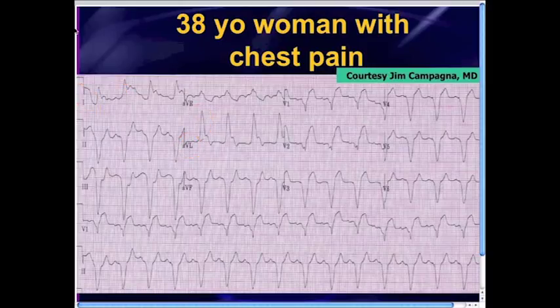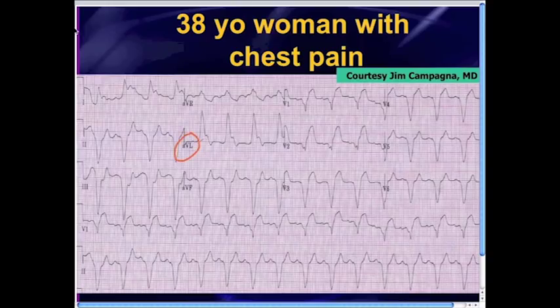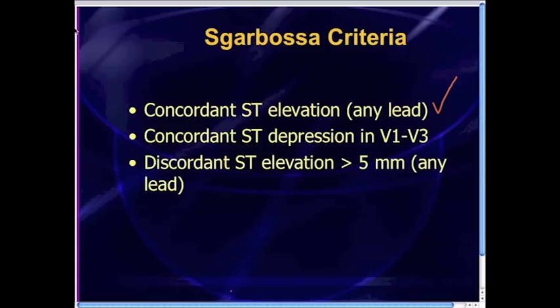All right. So 2 cases. One of them's a repeat from February 12th, but Dr. Anderson is provided with yet another case of a patient with an acute MI in the presence of a left bundle branch block pattern. So once again, Sgarbossa's criteria originally applied to left bundle, now can be applied to pacemaker EKGs as well. If you see ST elevation in the same direction of the QRS complex, like we just saw here in AVL and lead 1, if you see ST depression in the same direction as the QRS in V1, V2, V3, as we saw in Dr. Anderson's case, or if you see ST elevation in the opposite direction, but too much, by more than 5 millimeters, then that also is fairly specific for a myocardial infarction.